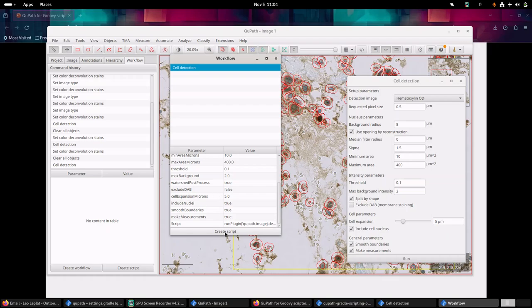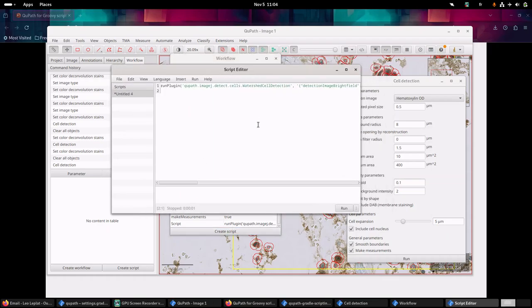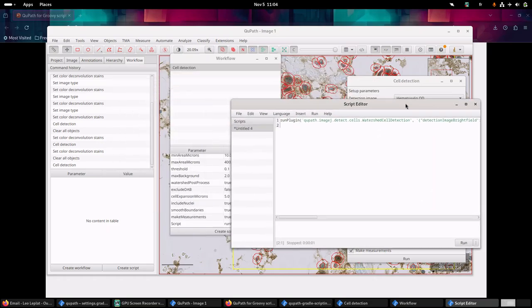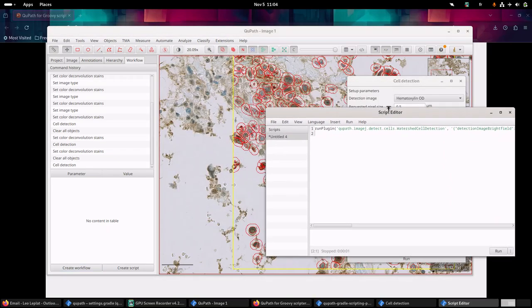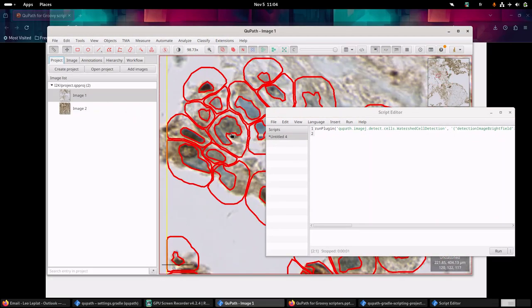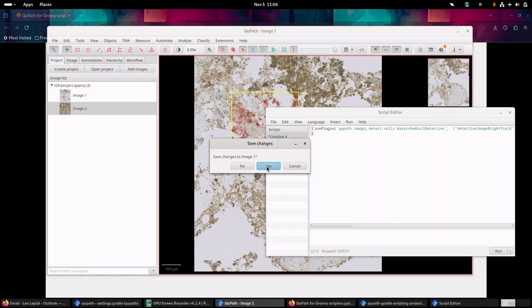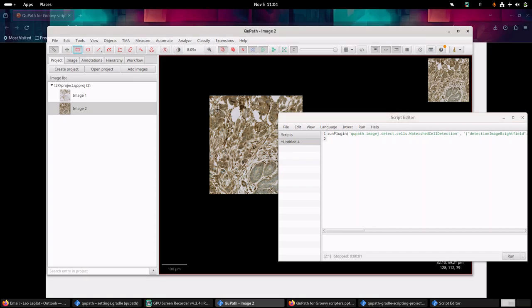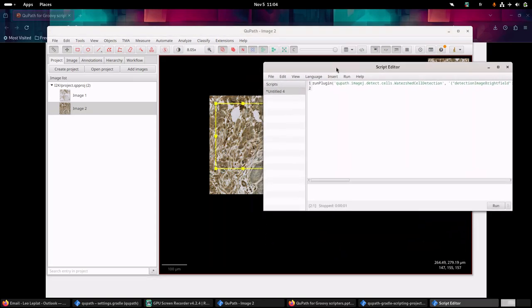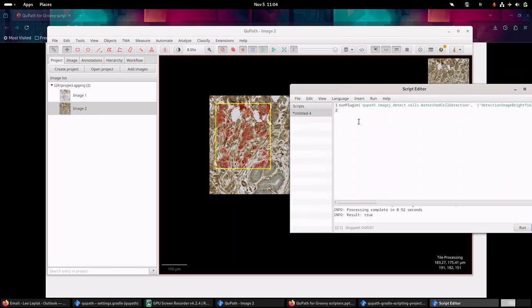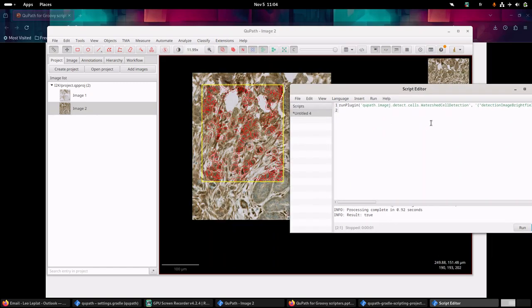The real usefulness of a workflow is that you can convert it to a script. If you click the create script button here, this new window will open. Now you can see that we have one line which says run plugin - run the watershed cell detection plugin. This is useful because now if you go to another image, you can select some part of the image, and if you just click on run, the same algorithm will be applied on this image with the same parameters. It's a way of using the same algorithm on different similar images.